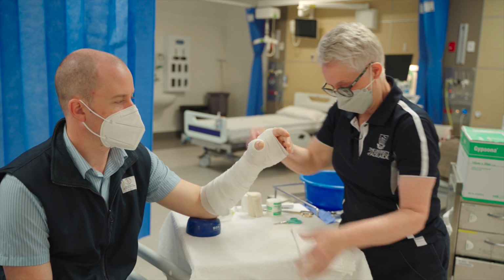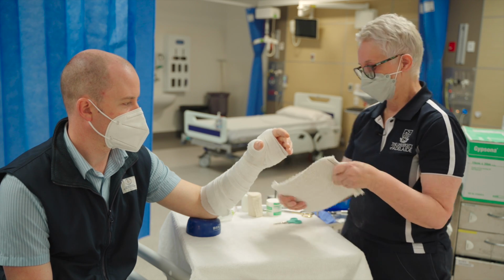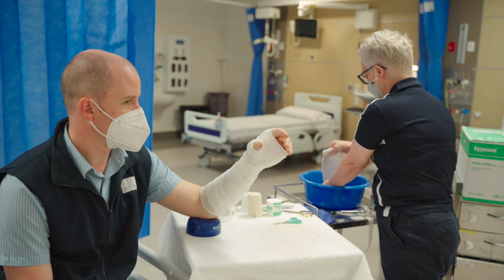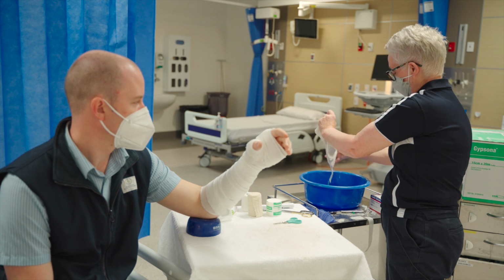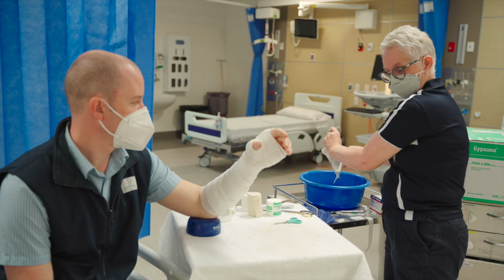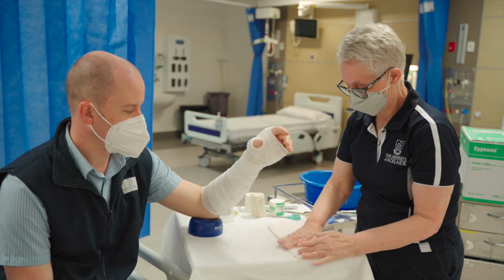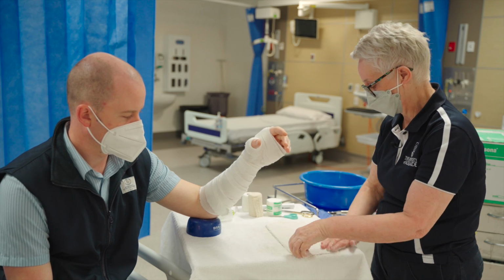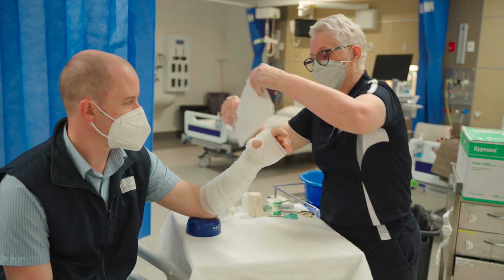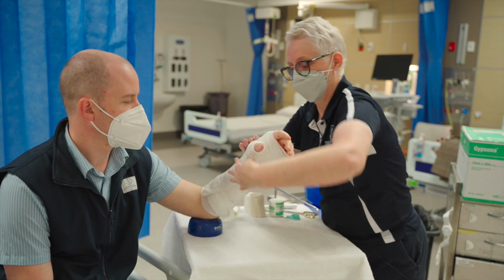We then take the next piece that we've got in our slab, our straight piece here, and we give that a dip in the water as well. Let the water drain. Place it down on our flat surface and just get all of that gypsona into that weave. So making sure we've got no creases, and then place that like so.